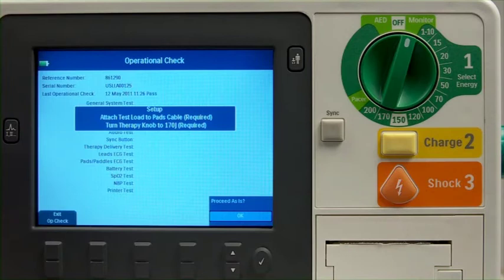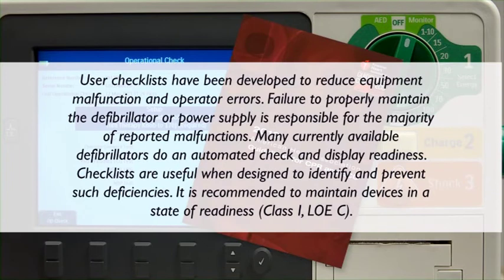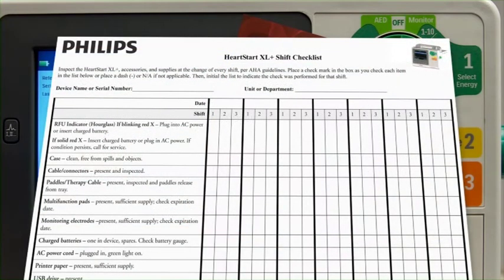To supplement these automatic tests, you should perform shift checks and weekly shock tests or operational checks on the device. The American Heart Association recommends completing a shift check at the beginning of each change in personnel to help ensure that defibrillators are ready when needed. Philips provides a checklist to complete a shift check on the XL Plus, including the ready-for-use indicator and related accessories and supplies.